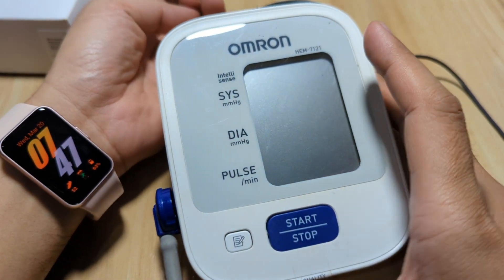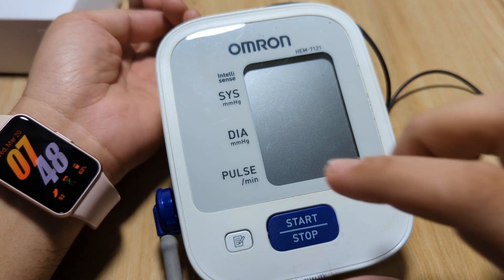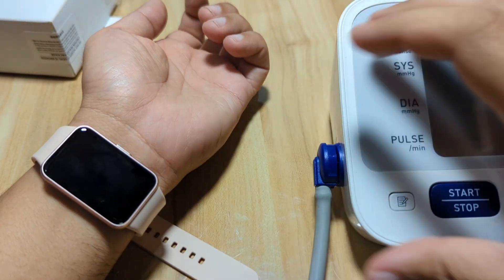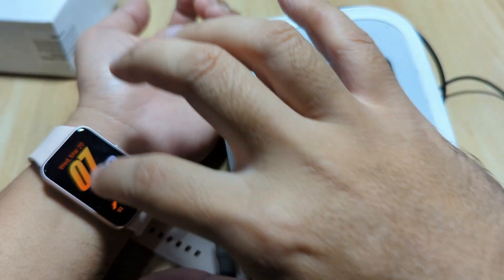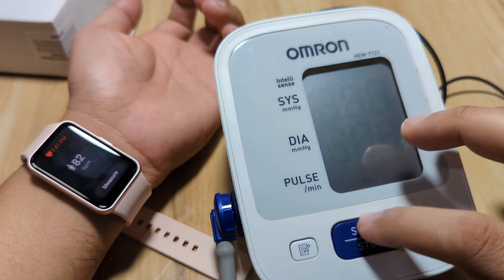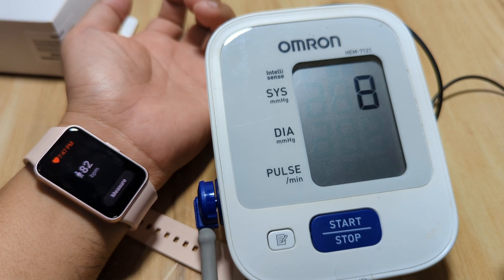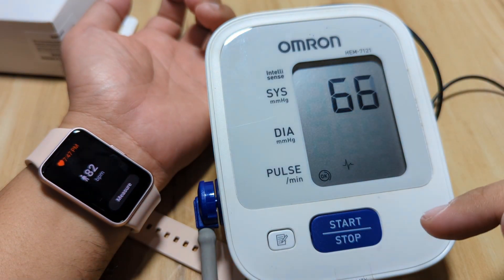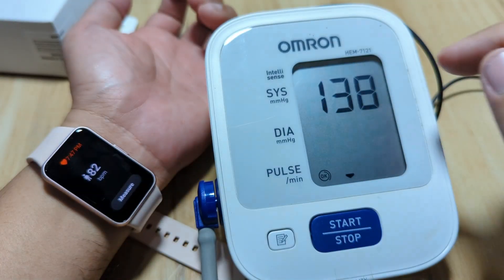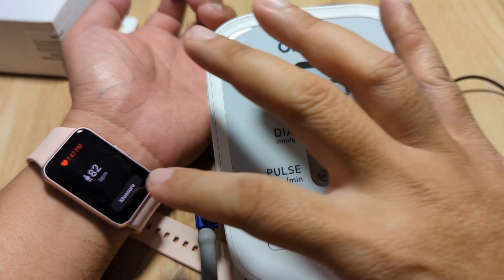So we have our Omron medical grade device here. Let's have a simultaneous monitoring. Let's wear this tightly so we can check. Let's go to our heart rate and then have a simultaneous monitoring. I'll start measuring when the air pump is done, so we're going to have a much more accurate result here.